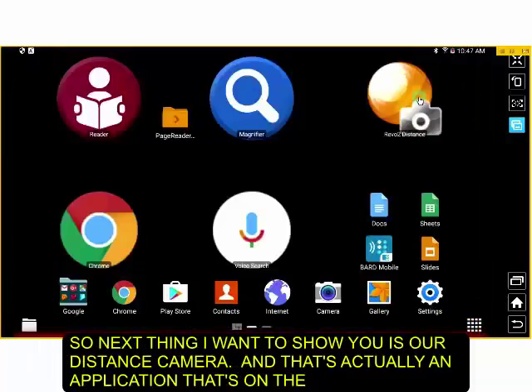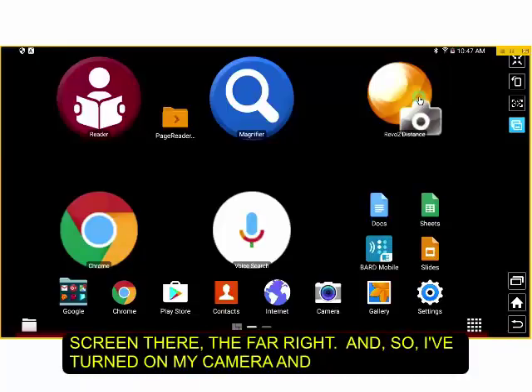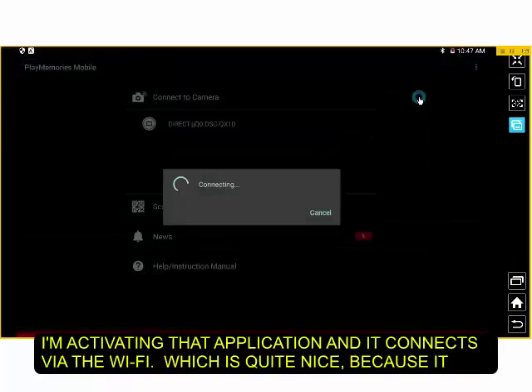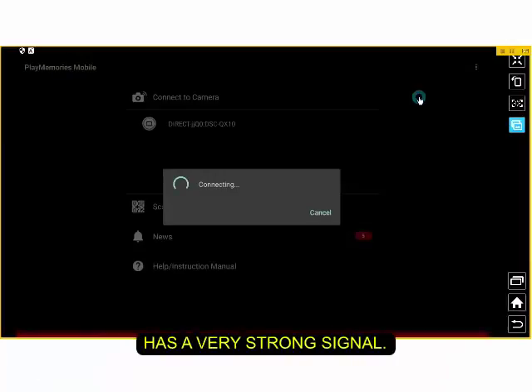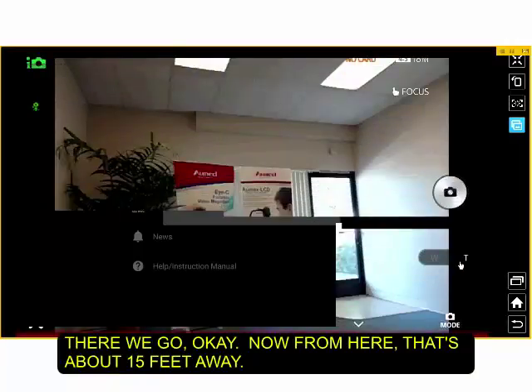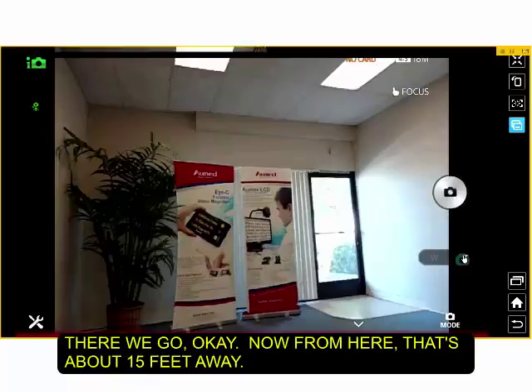So the next thing I want to show you is our distance camera, and that's actually an application that's on the screen there, the far right. And so I've turned on my camera. I'm activating that application, and it connects via the Wi-Fi, which is quite nice because it has a very strong signal. Oh, there we go. Okay. Now from here, that's about 15 feet away.